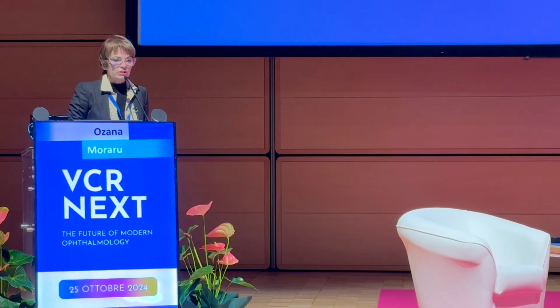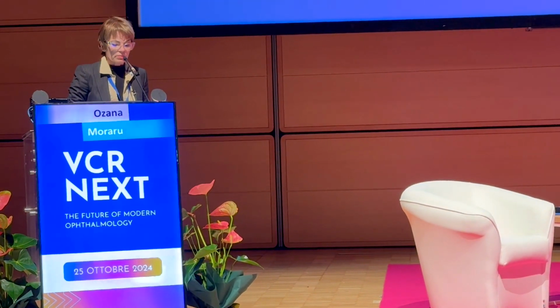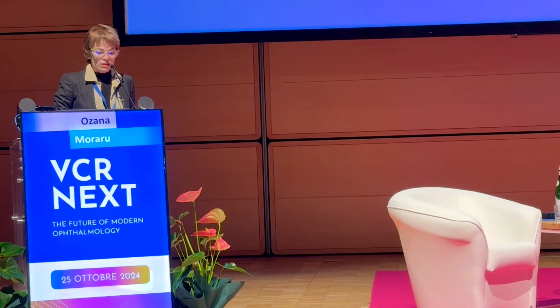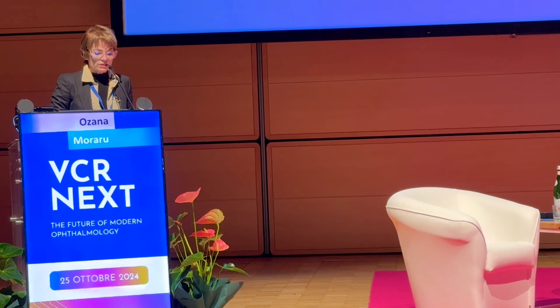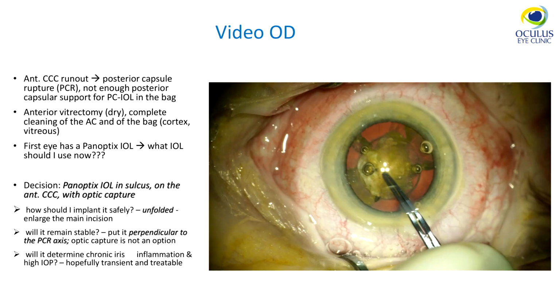And the femtolaser technology was chosen by the patient, but also I can recommend it sometimes when the pupil is large enough or in other cases. It's not a topic of this presentation, so I'm gonna be faster. The first surgery was in the left eye and it was uneventful. The second surgery was the next day in the right eye, but I had a posterior capsule rupture, and you will see it was originating from the anterior capsulotomy run out.